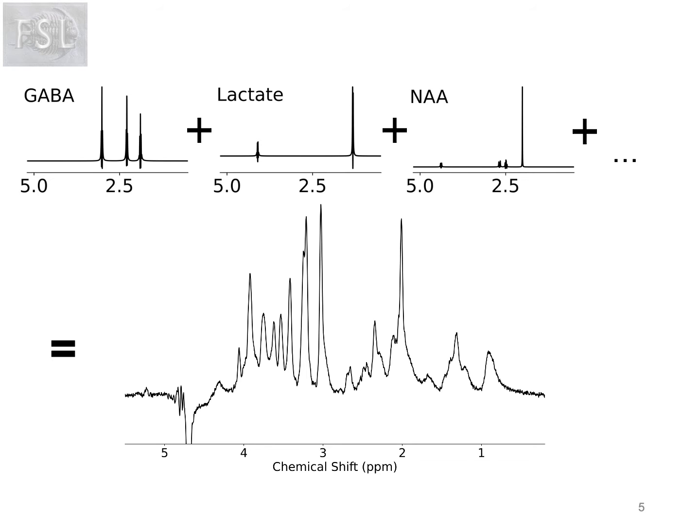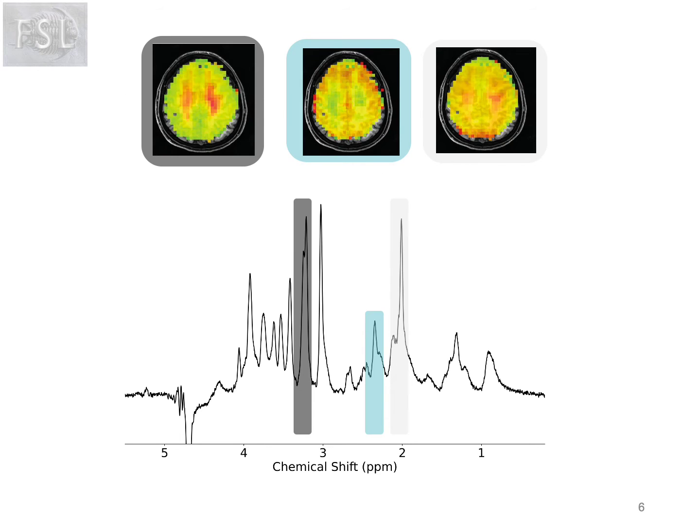When we collect a spectrum from the human brain, we observe all of the fingerprints summed together, weighted by the relative concentrations of those neurochemicals in the tissue we are imaging. By picking out the unique signals, we can then make images of the concentrations of the metabolites in vivo. These are known as metabolite maps, and here we see 3 such maps for total choline, glutamate, and NAA.